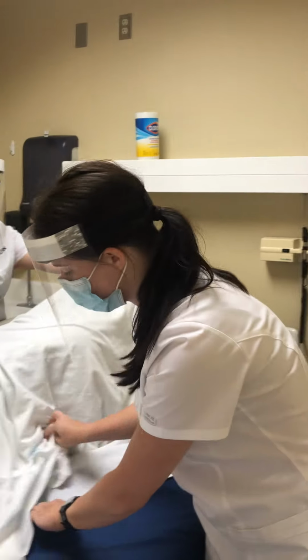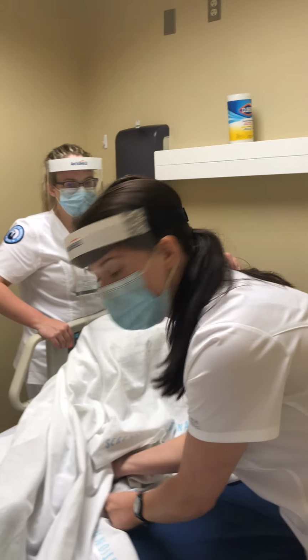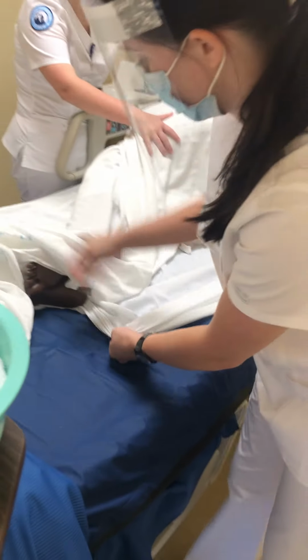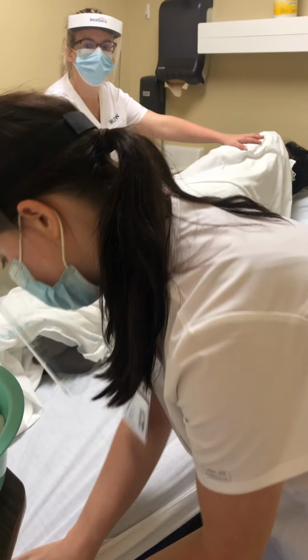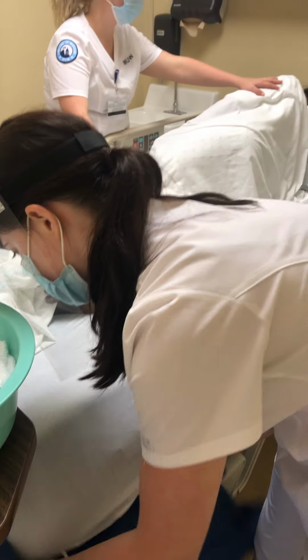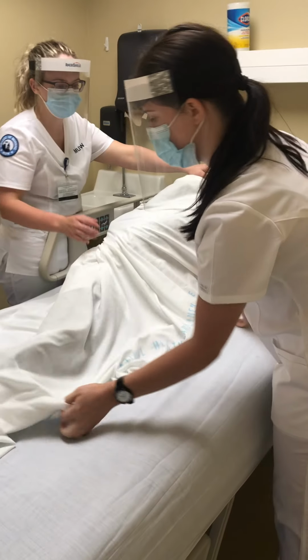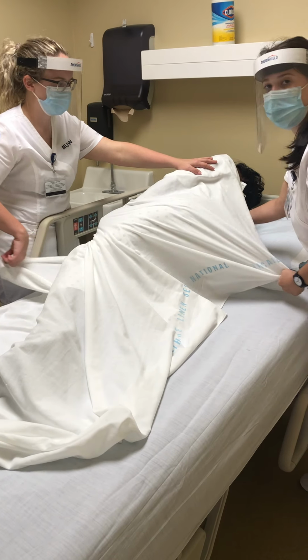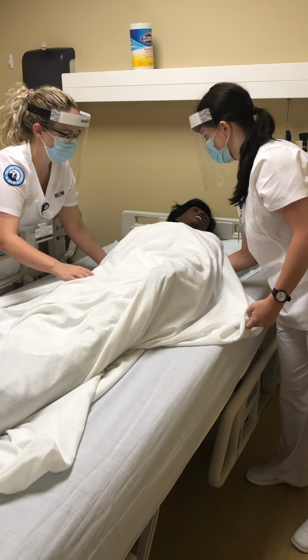Anytime you have to assist a patient by moving one of their extremities, grab that joint to lift so you don't cause an injury. Again, I'm going to keep it as tight as possible. Keeping the patient covered, we're going to roll her back to her back.